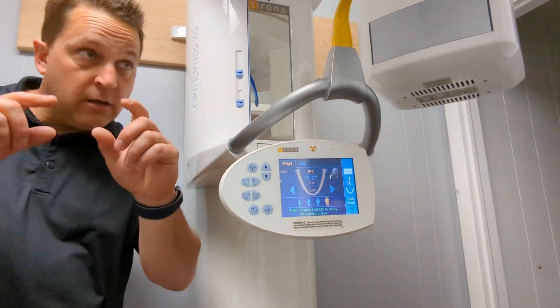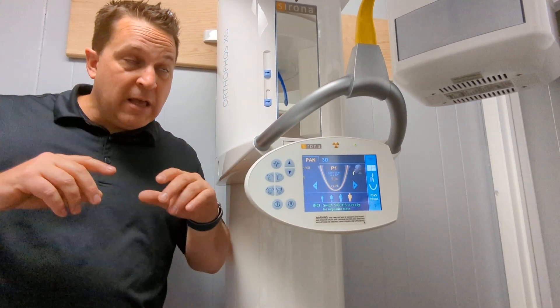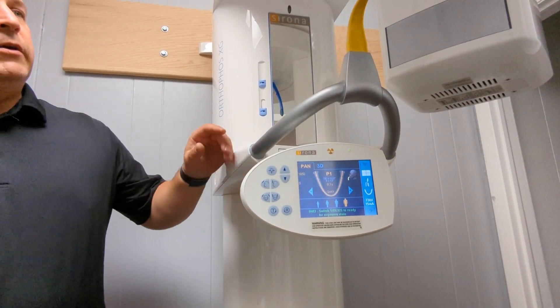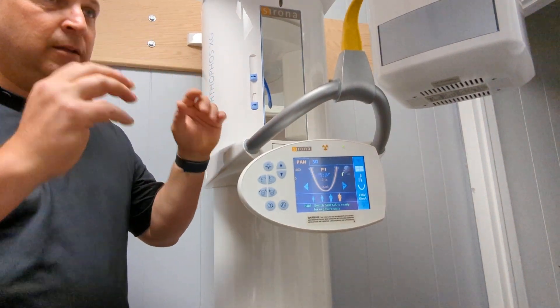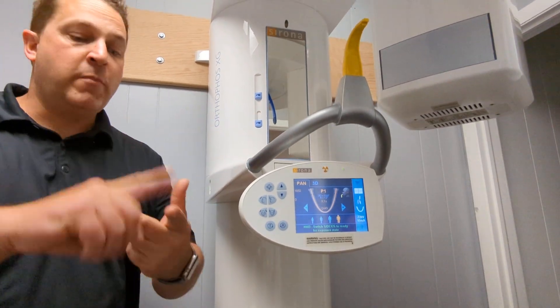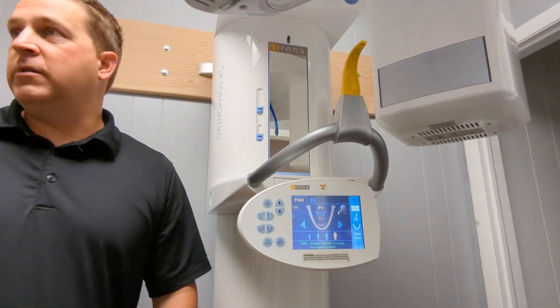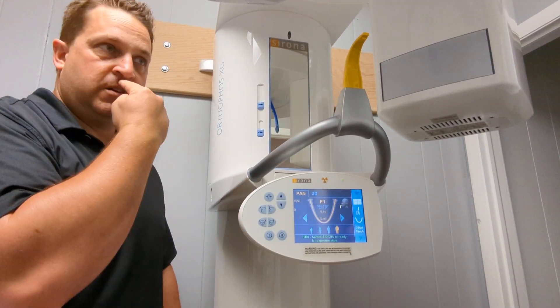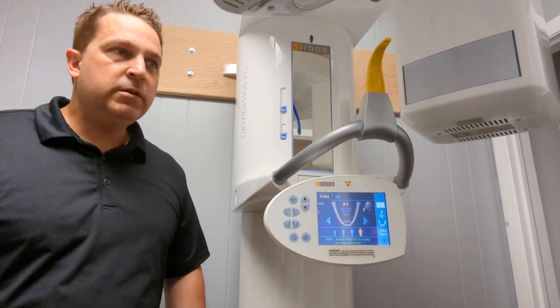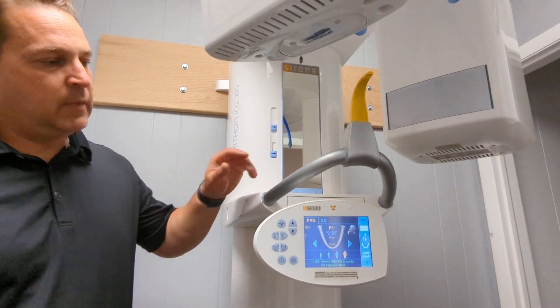Your kV is your contrast — that's what gives you a good looking image. mA is just what pushes your kV through. So you need a bigger ball of wax to make the image look better. Don't be afraid — I don't care if you're male, female, old, or young. All I care about is how much distance between the neck and front teeth on panorexes. That's all I care about.